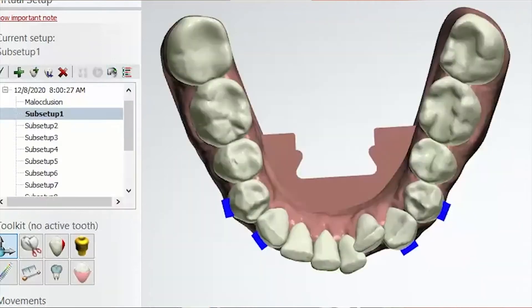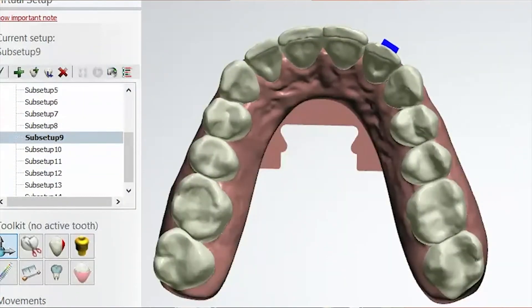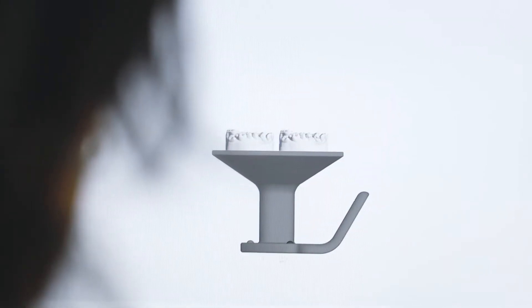At this stage, the clinician can show the treatment plan to the patient during an in-clinic consultation, providing them a preview of how their teeth are going to move and how long it will take. Once the design has been approved, our trained technicians use the data underlying the simulation to design the series of arches.